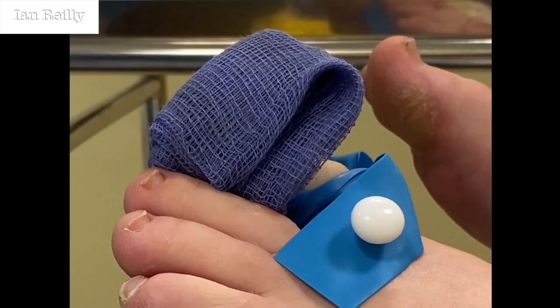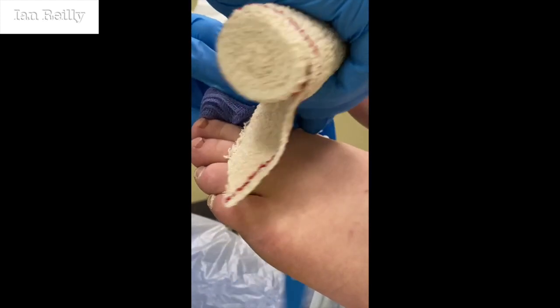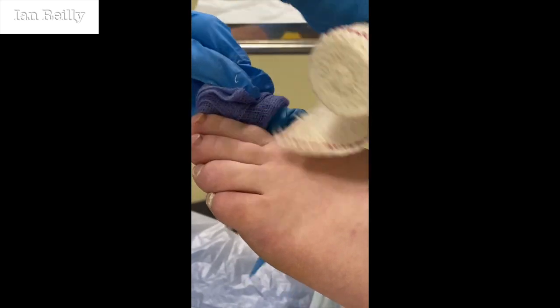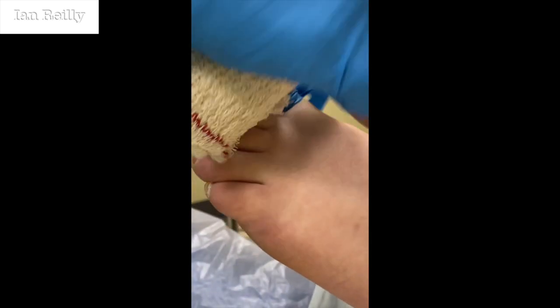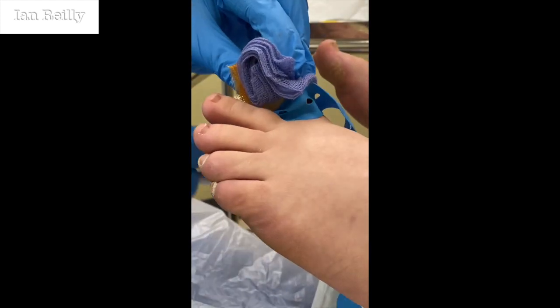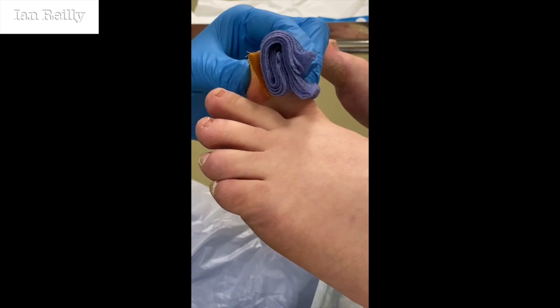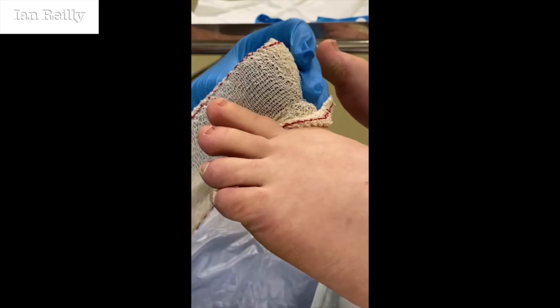Alrighty guys, so I'm just going to now take that tourniquet off and see how much claret we get. Second most difficult part of the procedure is getting these things off. Look away, I might have to edit the video. I did a couple of these yesterday. It took me about 20 minutes to get one of these things off. So we just have a little look, and then we put on a wee bandage.